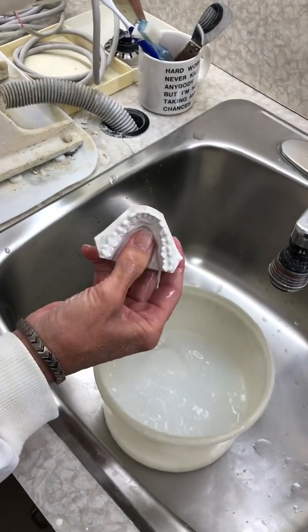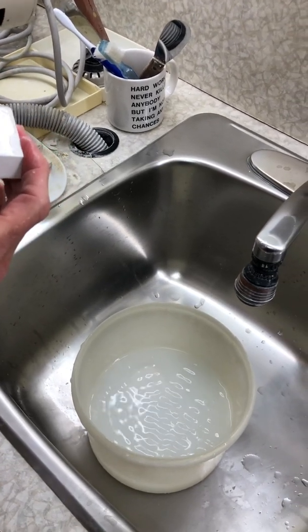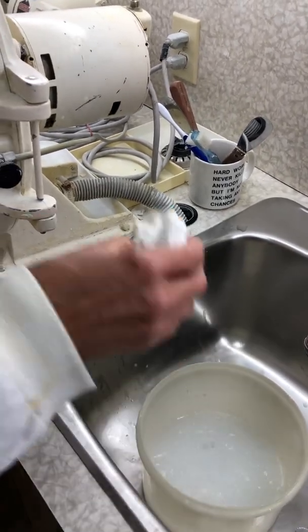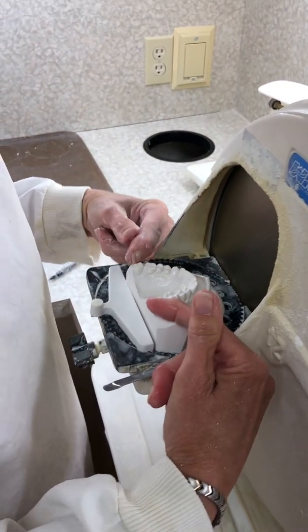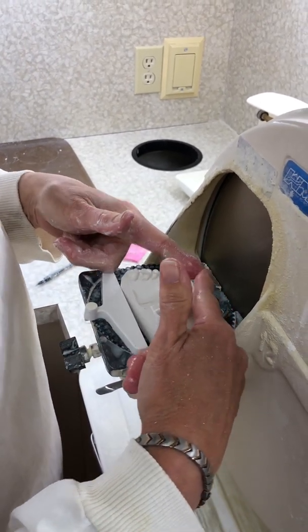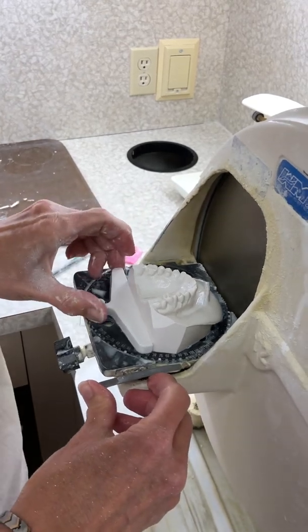And there we go. Now, the second stage is finishing it, and we'll be picking off some of the little bubbles and stuff that are around there. Let's do the top one. So on the top one, we do the 115 with our corners, then we do 60, and then we do 30. So a few more little cuts to it and stuff. Let's start with the 60.